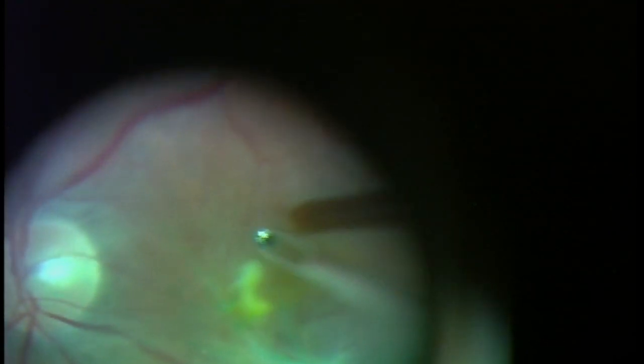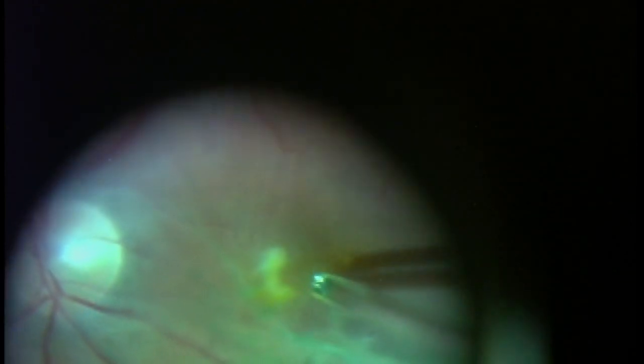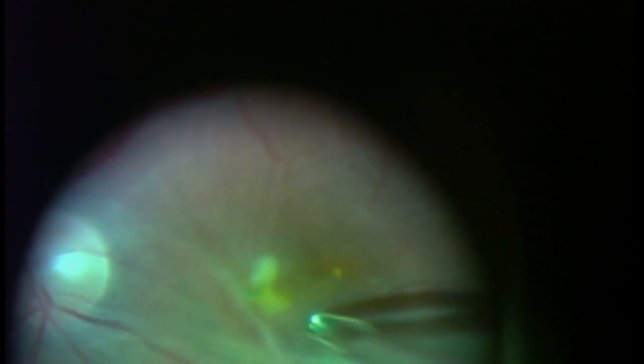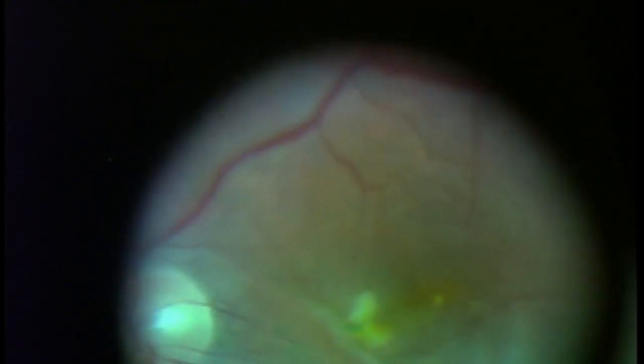You can get the sense that I'm starting to pull on the entire surface of the retina. In just a second, you'll see it start to come off in a sheet. Now, this doesn't always come off easily. I had some moderate difficulty in removing this membrane, especially in one piece.